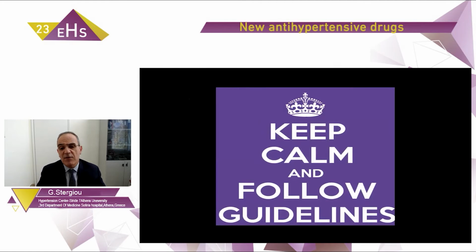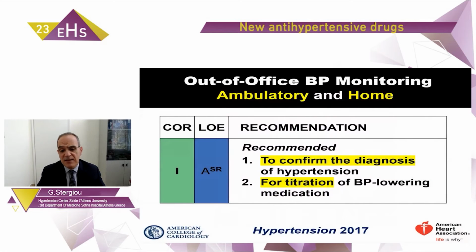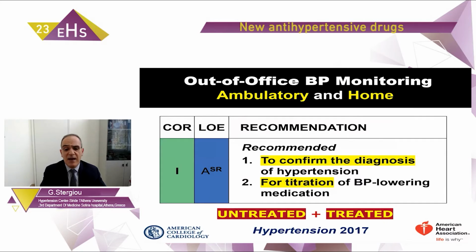Now, moving to the last part of my talk, let's focus on the guidelines, how to use this method today in clinical practice. And I think the American guidelines in 2017 made an outstanding recommendation and said that out-of-office blood pressure, ambulatory or home, should be used first to confirm the diagnosis of hypertension. Second, whenever treatment titration is to be decided. This means that the decisions to start treatment and to titrate treatment are moved out of the office with out-of-office measurements, ambulatory or home. And they made this recommendation for both untreated and treated individuals.